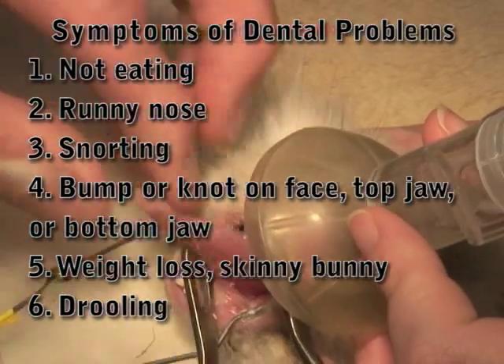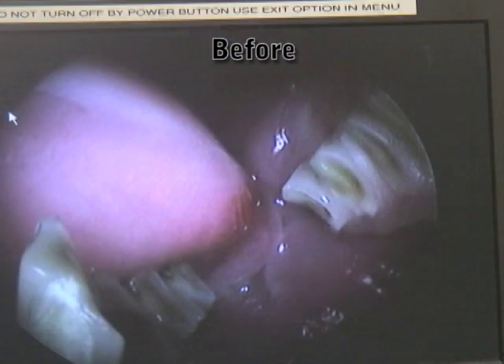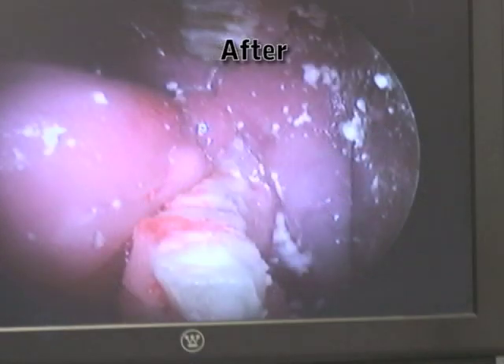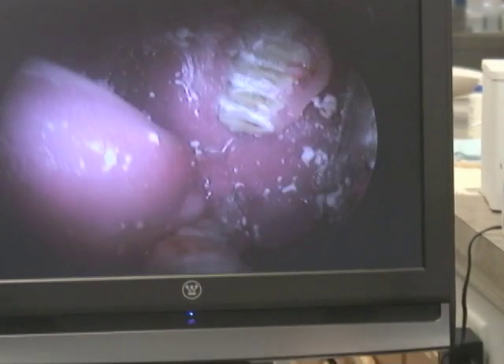Let's see if we can put that on the big screen. This is that same side where we had that really long tooth — we trimmed that tooth down. Now you can see all the teeth are pretty much at the same level. We've trimmed them back a lot. We trimmed the point off that back upper molar right back here. That side actually looks pretty good.